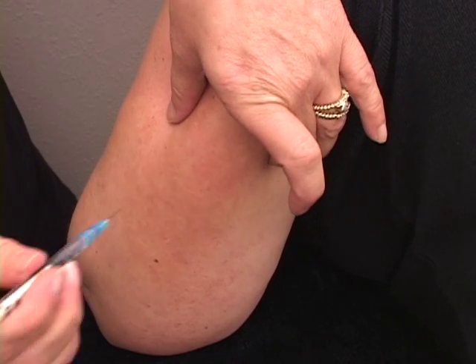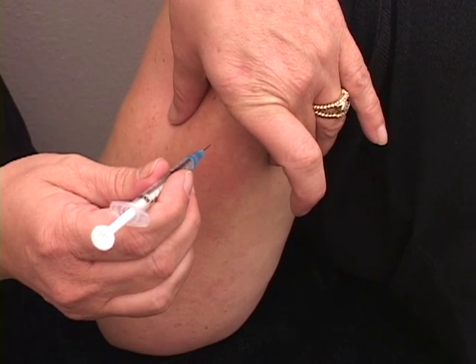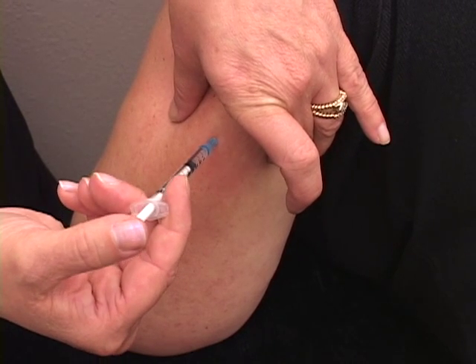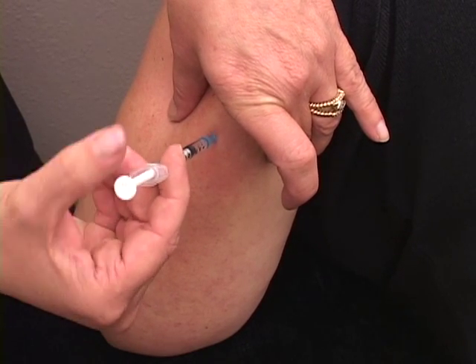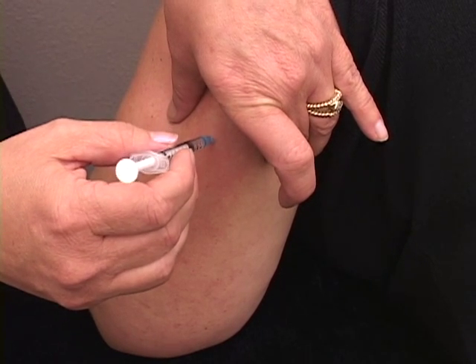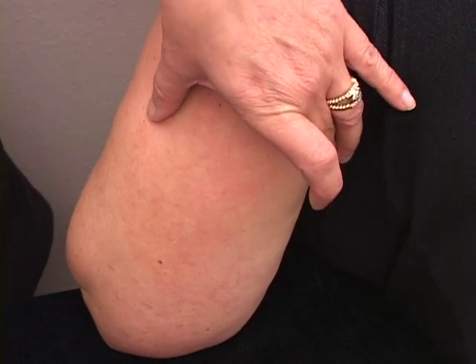Remove the cap from your needle, pinch, and go straight in. Then slowly inject your fluids. Once you have it all in, count to ten, then remove your needle. And your injection is complete.